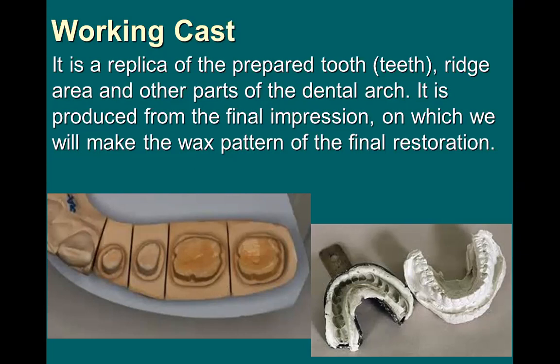And this will make it possible for us to make a wax pattern of the crown or bridge or different crowns, to continue our steps of construction and final restoration.